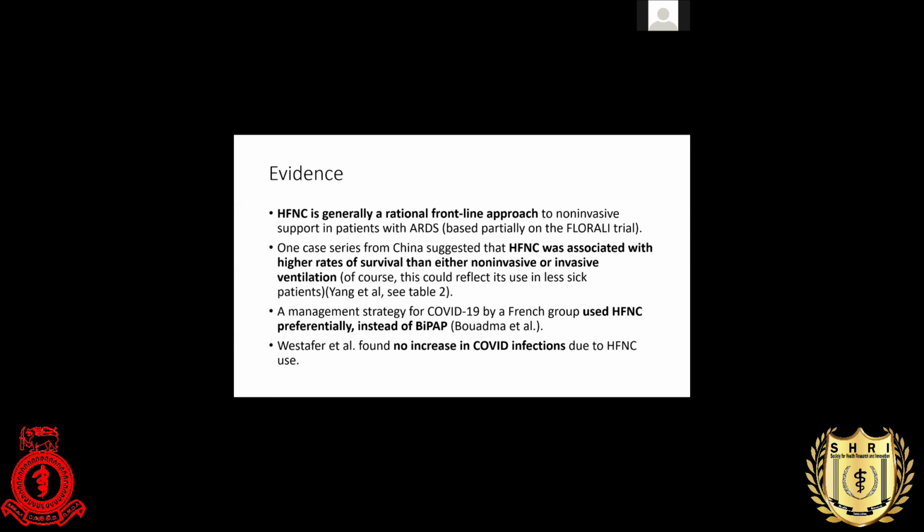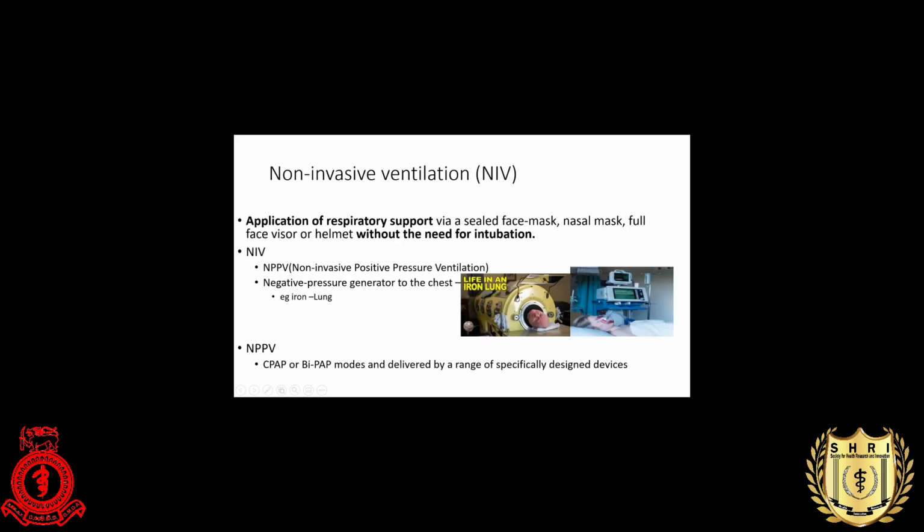Let's discuss the evidence. There is a lot of evidence to support the use of high flow nasal oxygen cannula in COVID pneumonia patients as an early treatment strategy. One study done in China found a higher survival rate in patients with high flow nasal cannula than with non-invasive and invasive ventilation. And some say HFNC is preferentially better than BiPAP. All right, that's the end of high flow nasal cannula, and we will move to non-invasive ventilation.